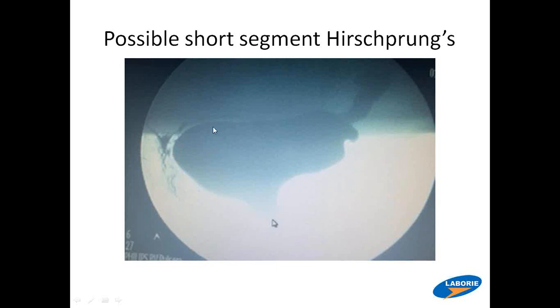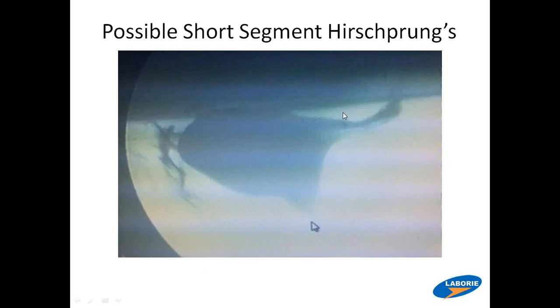So I want to show you that this contour is a little abnormal. It should go like this. And here's the anal canal at the arrow. But instead she's got this big bulge. So she starts out with a big rectocele. So already I'm thinking, there's something. That's a good reason to have outlet dysfunction and to feel incompletely empty. So we go to the next step.